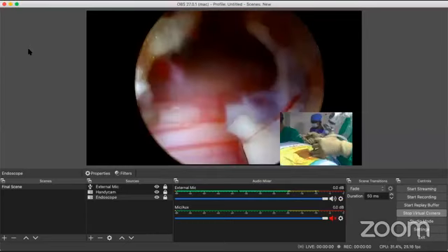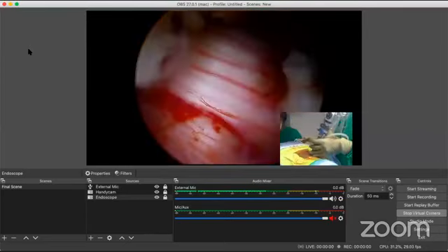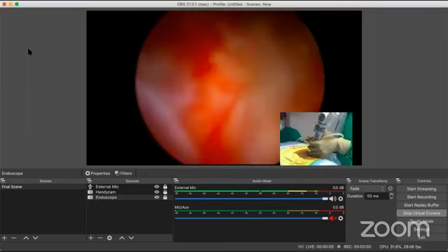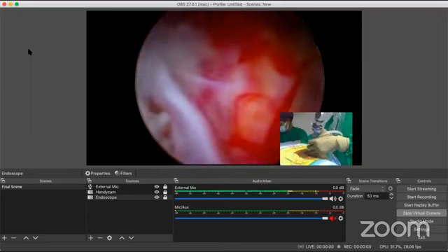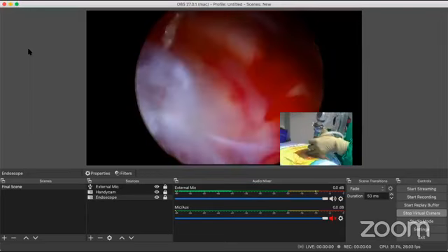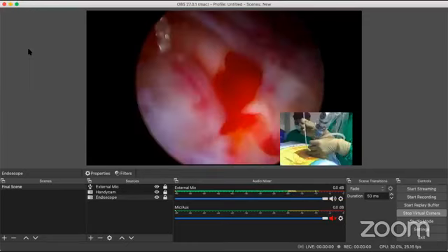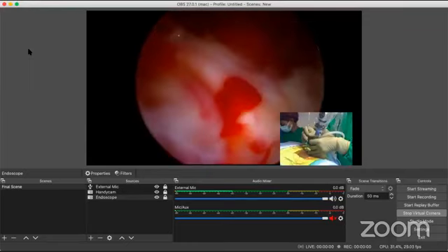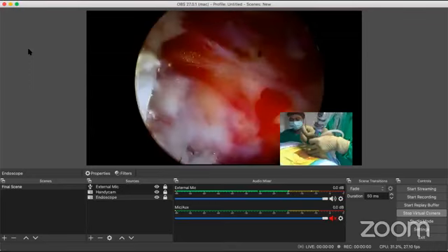Yes, you can see the entire spinal cord in all its beauty. Yes, sir. You can see the entire nerve root, which is free. I also showed you the dissector. I also showed you the osteophyte, which is anterior to the nerve root. Over here, you can see it from its shoulder. Yeah, this here is the osteophyte.